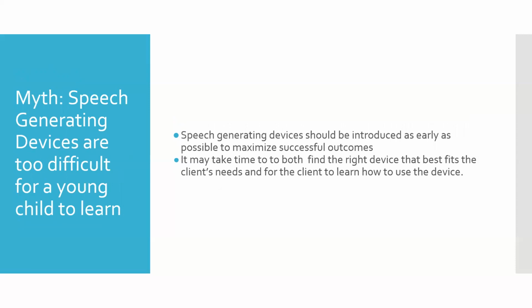Another myth is that speech-generating devices are too difficult for young children to learn. The truth is, speech-generating devices should be introduced as early as possible to maximize successful outcomes. It may take time to both find the right device that best fits the client needs and for the client to learn how to use the device.